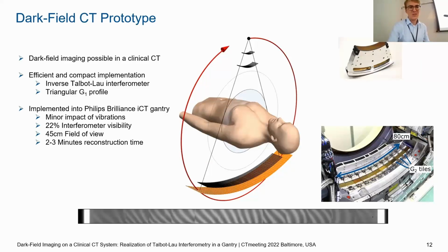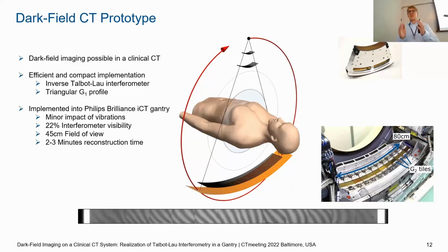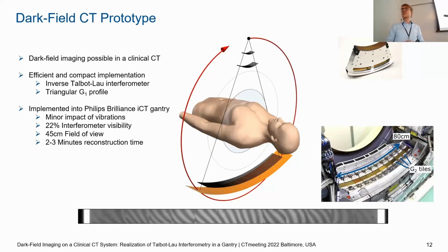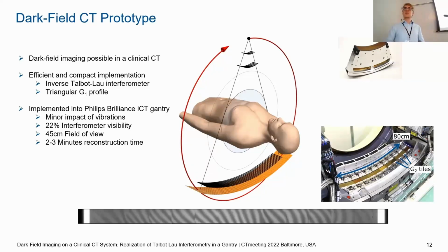You mean the shadowing due to the increased size of the focal spot? Yes. At the 0 degree fan angle, it's a square focal spot, and at 25 degrees it is not, because all the gratings are basically cylindrical, right? They are all focused to the X-ray focus. They are bent to the focal spot.